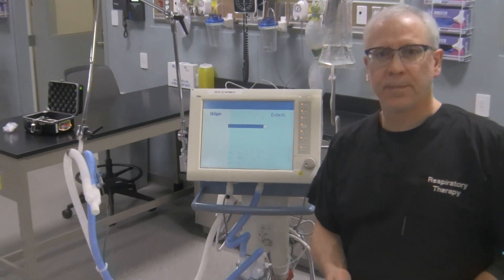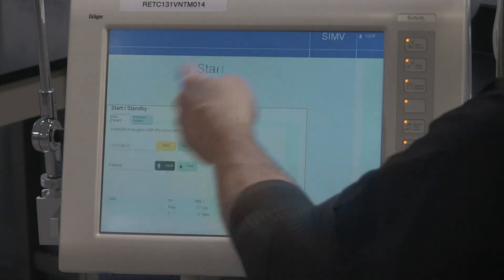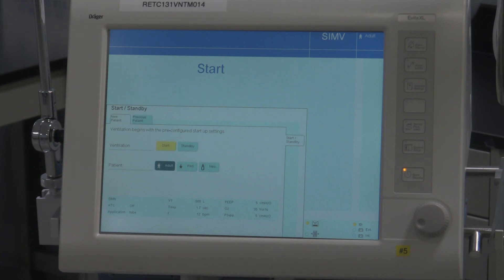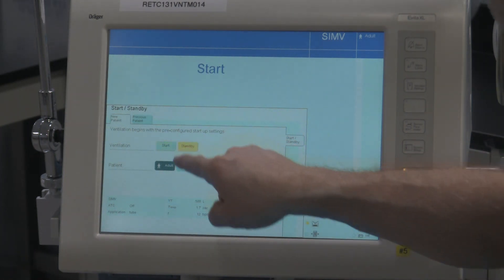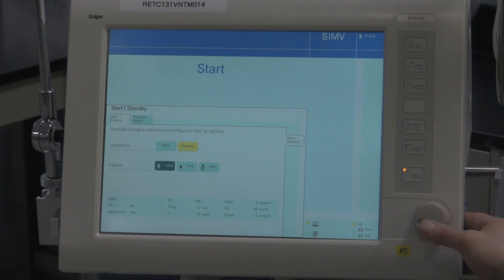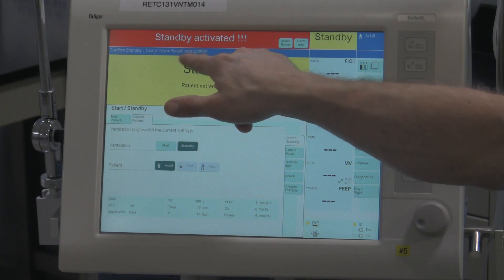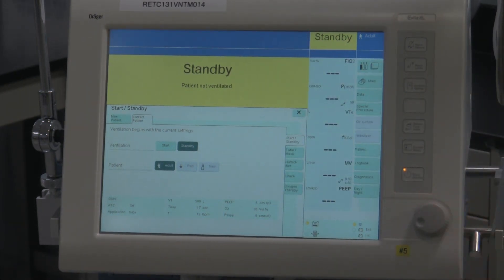I'm going to zoom in a bit because I want you to see the screen and how to put this into standby. So it's doing its little power-on test right now. It's in this start configuration, but we want to put it into standby. It's a couple-step procedure for putting the ventilator in standby. Hit the standby tab right over here. Click on the button right over here to confirm it. Then it says to confirm standby, touch the alarm reset and confirm. Now the ventilator — when you see that nice big bright yellow sign on there — confirms that the ventilator is in fact in standby.